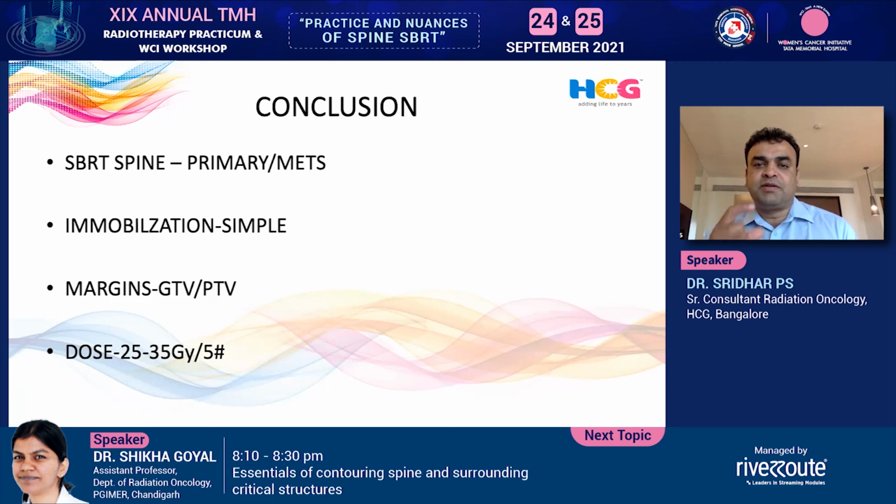Depending on the number of sites, it is also important. Time taken is also important. So, as I told you, immobilization should be simple. For margins, GTV versus PTV, the GTV, which is acquired through both PET-CT and MRI, is what I'm looking at. And a dose of 25 to 35 gray is the most common, whether it is a primary or secondary.